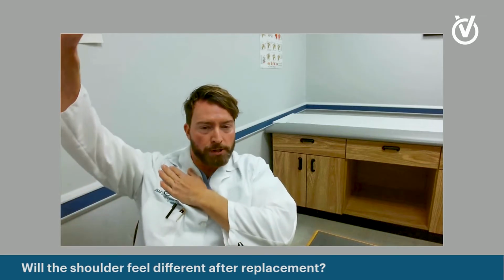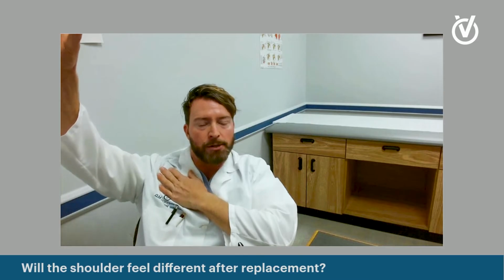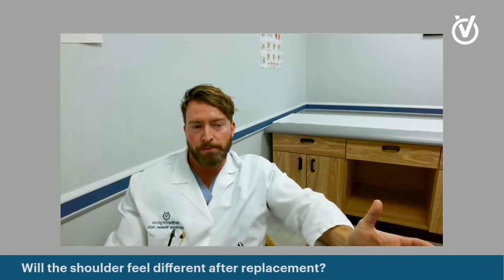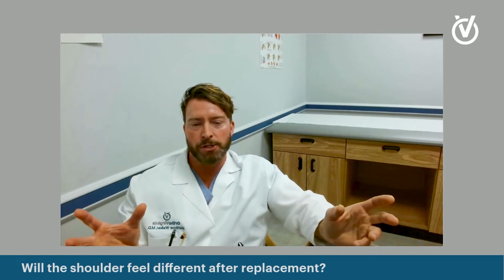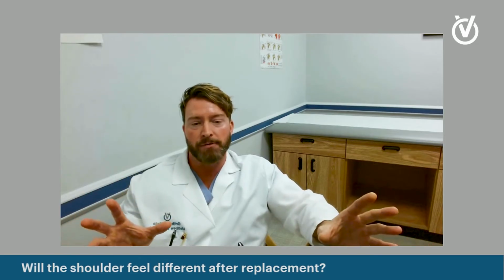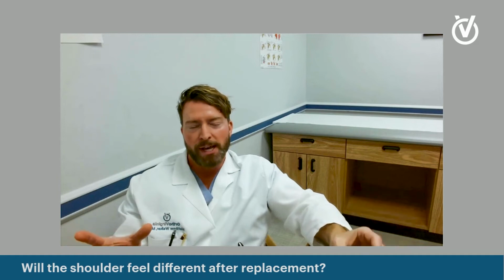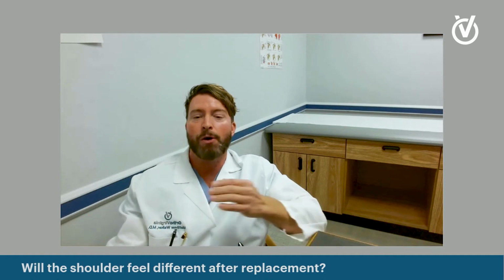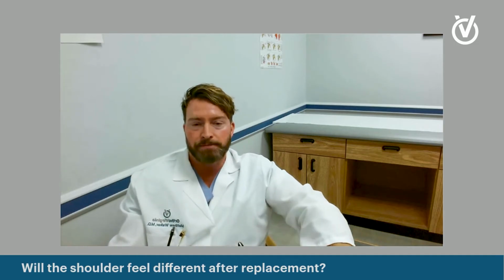It will move a little differently because it's designed to make the deltoid muscle, the muscle on the outside of the shoulder, move the shoulder for you. So we're changing the mechanics of the shoulder a little bit to compensate for the bad rotator cuff with a reverse. So you will feel a little difference in how it moves and maybe even how it feels on the outside of your body.